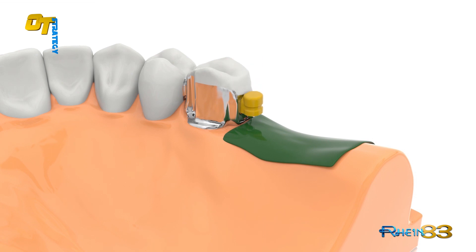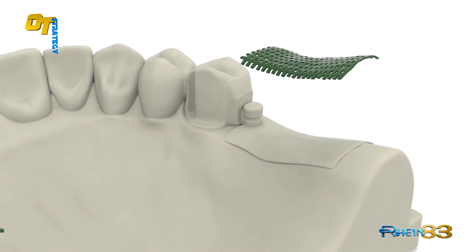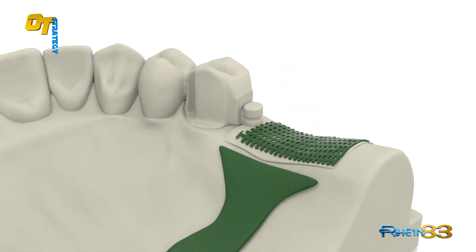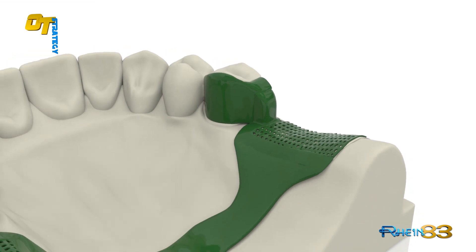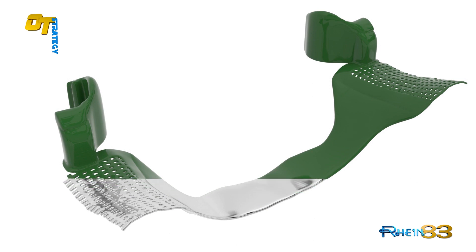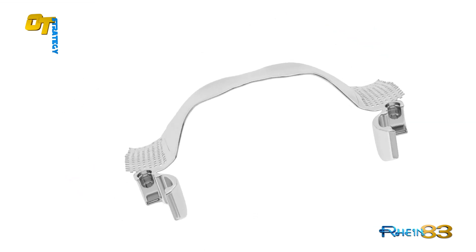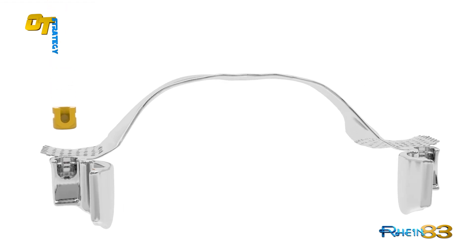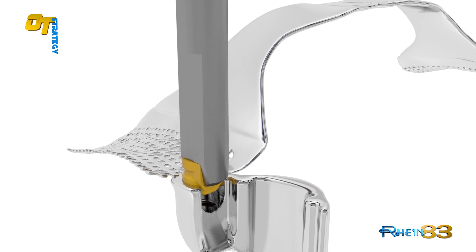Insert the retentive OT strategy cap over the cast sphere and prepare the model for the duplication technique. Proceed with the duplication phase. Wax the framework and cast. Insert the yellow retentive OT strategy cap into the frame housing and finish the removable framework.